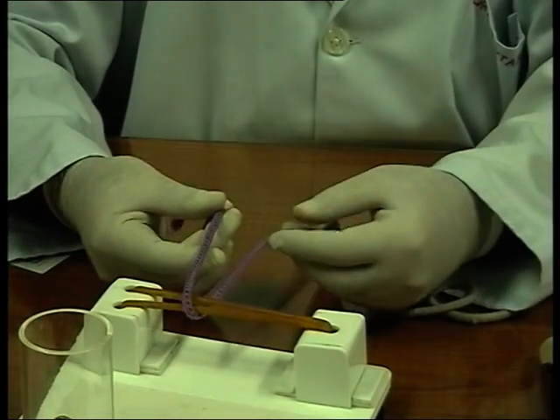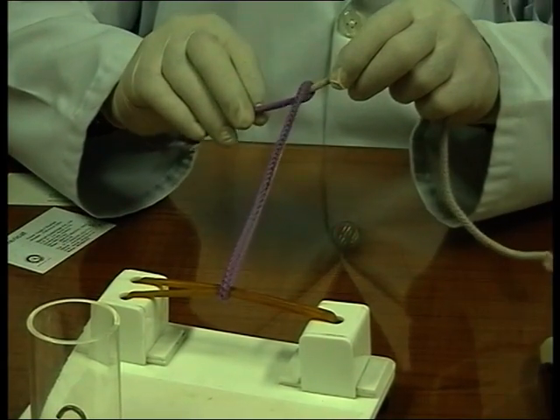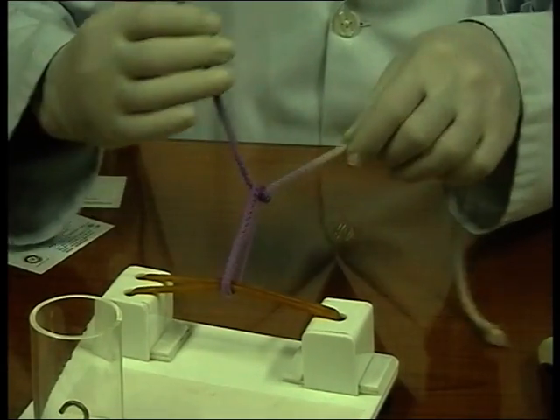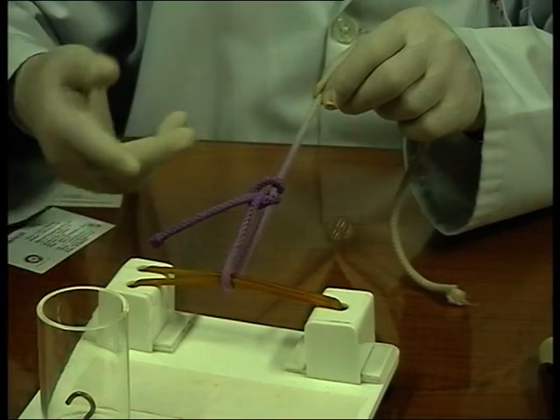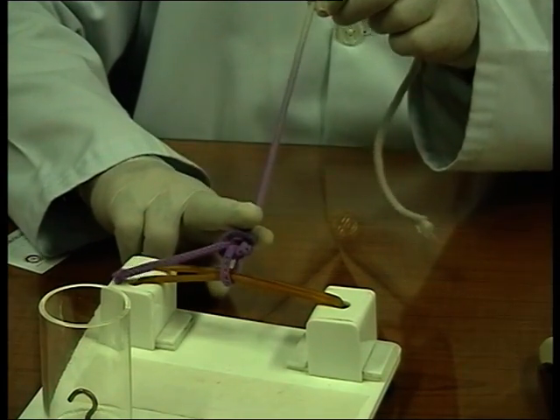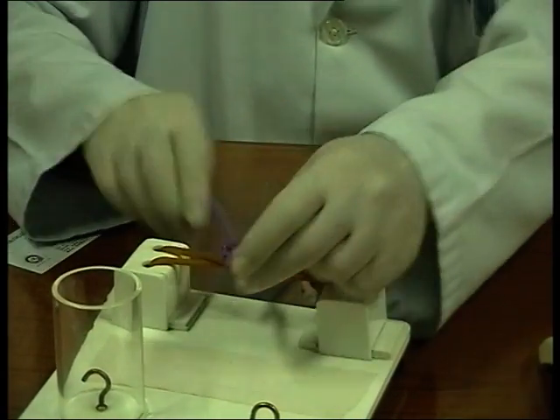Now the third knot that I taught you today was the slip knot, which you use in tissues which are lying at depth, and you're trying to negotiate the instrument. You want to go beyond the instrument so that you don't have to release them, you can release them one by one. Now this is a knot which is going to slip. Once you've achieved the slipping, the instrument is out, you have space to work, you can put a proper knot on top of it.